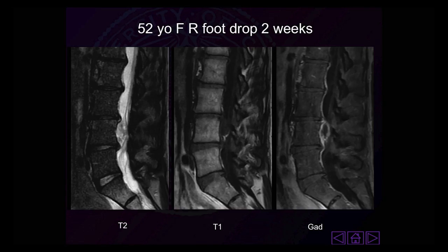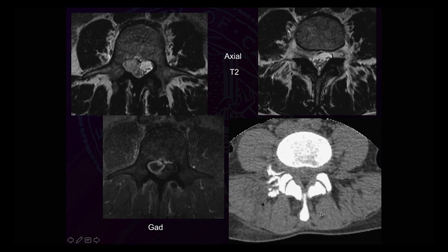And unlike the patient that was able to undergo the minimally invasive surgery, she was not able to take time off, even though I know now it can be very short, but she wasn't able to take time out for her surgery. So she asked for help to be more comfortable during that time, waiting for the disc to resorb. And so here you can see a huge disc that's crowding the spinal canal. Here's her injection. And she was comfortable after that.